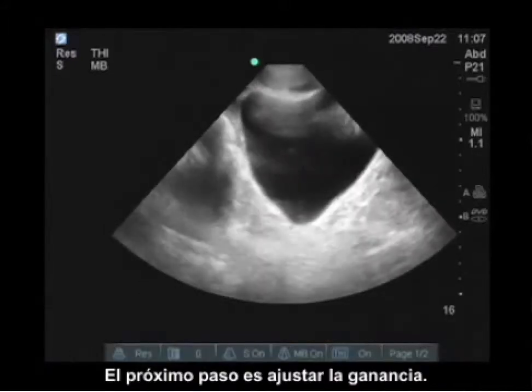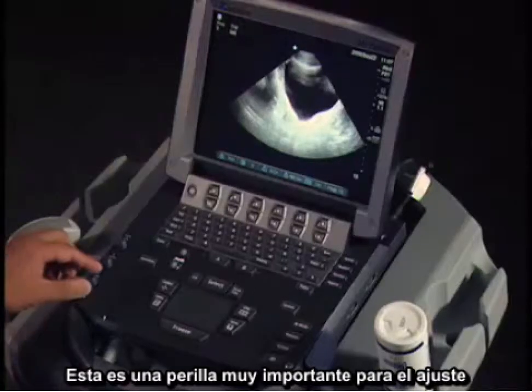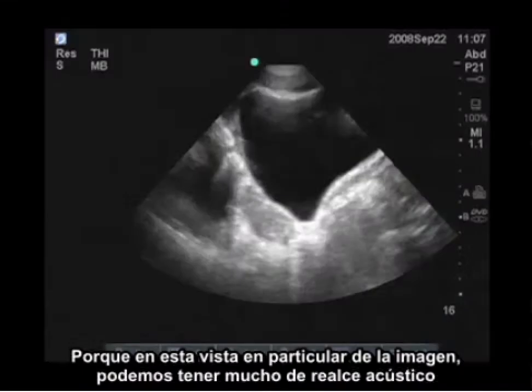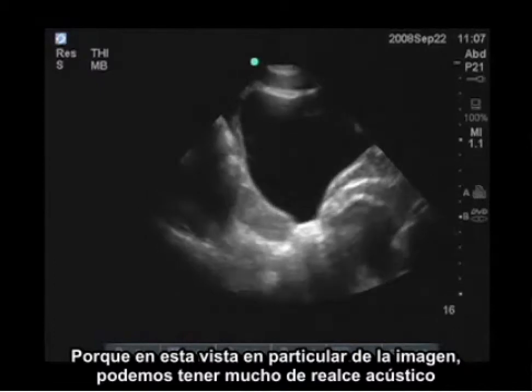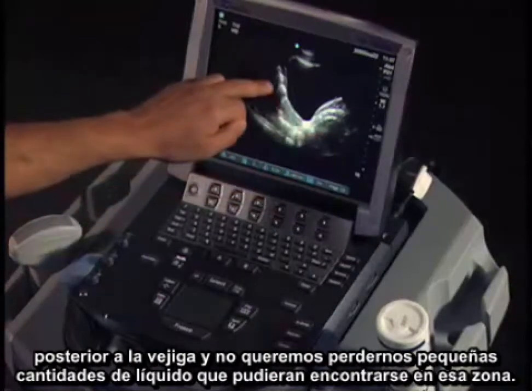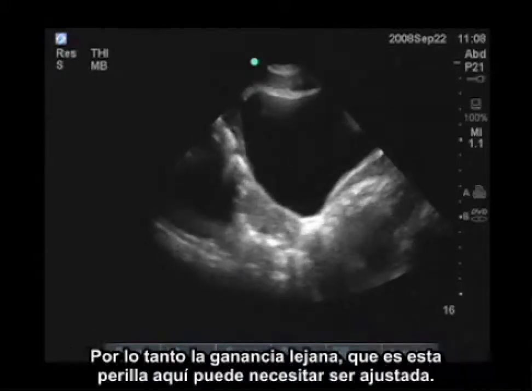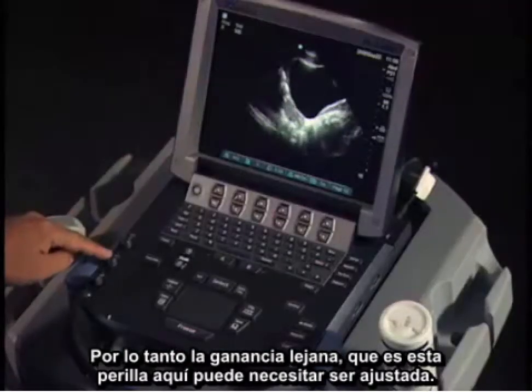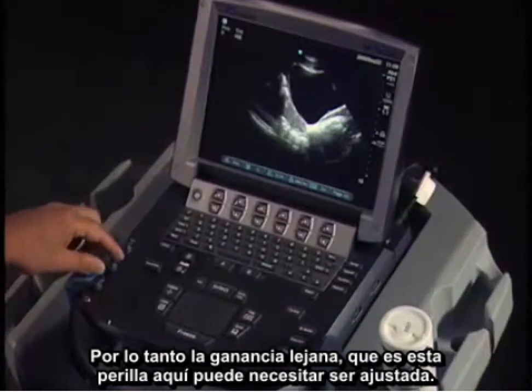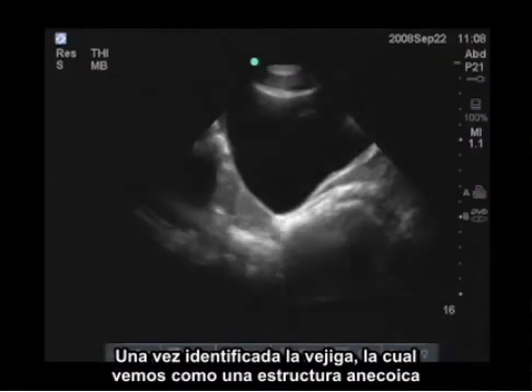The next thing I notice is that I do need to adjust the gain. This is an important knob to be careful with, because in this view particularly you can have a lot of acoustic enhancement posterior to the bladder, and we don't want to miss small amounts of fluid. So the far gain, which is this knob here, may need to be adjusted additionally.